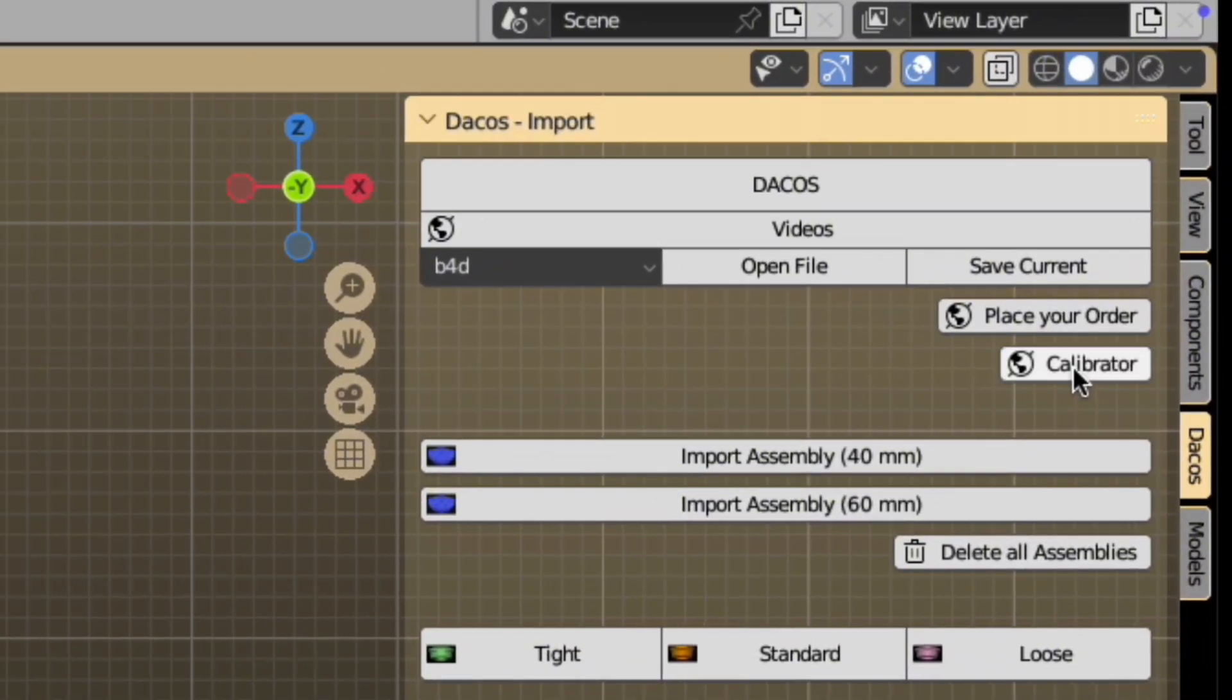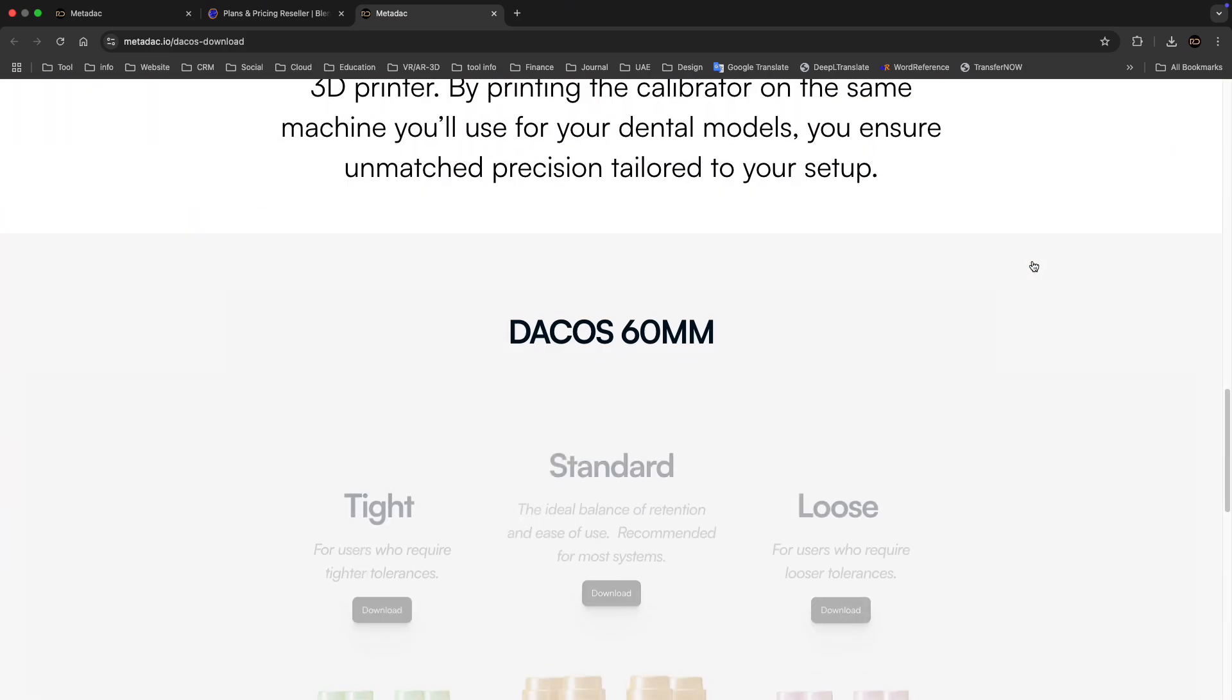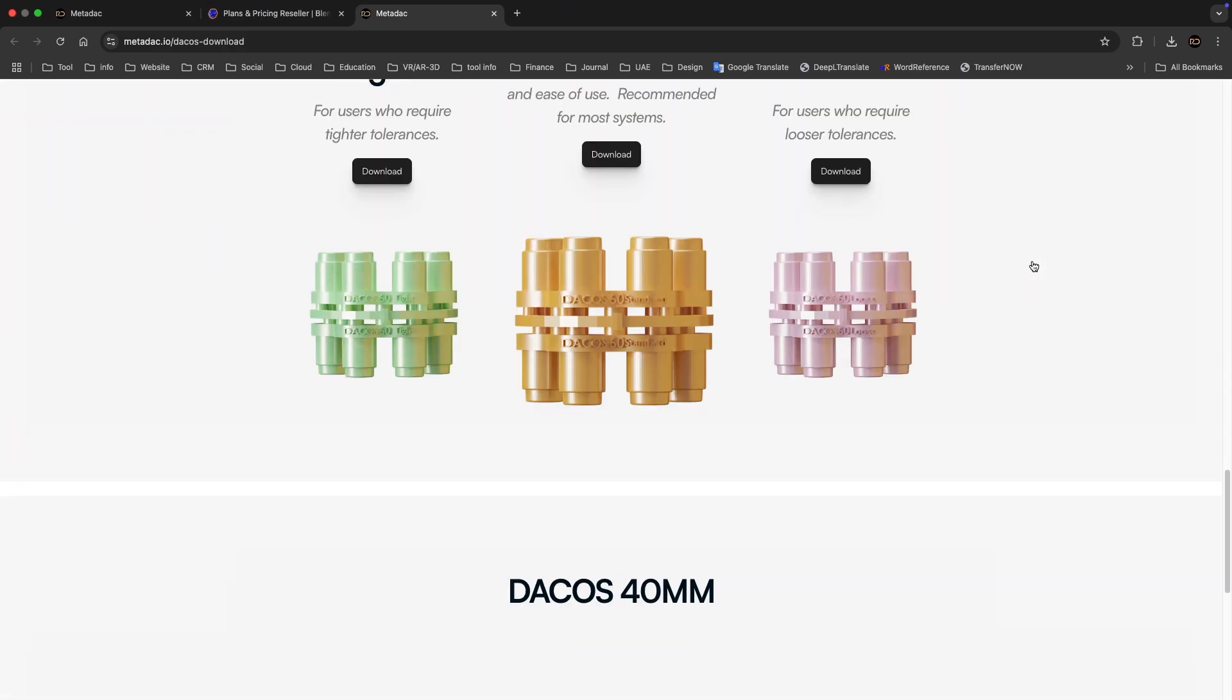You will find a button directly on the software, and you can choose from three different offsets: tight, standard, and loose. It is recommended to use the standard offset.